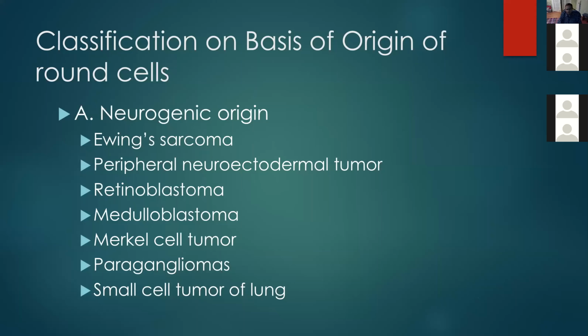It's not a very specific marker, but it is a very important marker that marks things of neurogenic origin. And by neurogenic, it doesn't mean it has to come from the nerves itself. It comes from the neuroectoderm, the material that forms the spinal column. Anything that comes out of the neural crest will typically stain positive with S100, unless it gets too poorly differentiated.